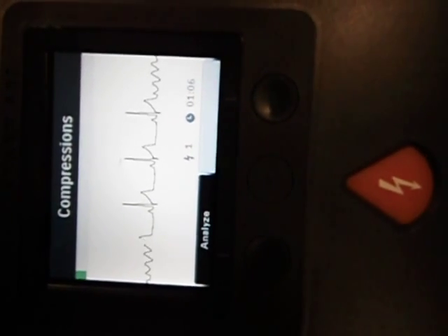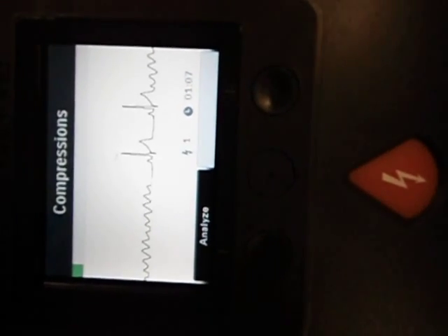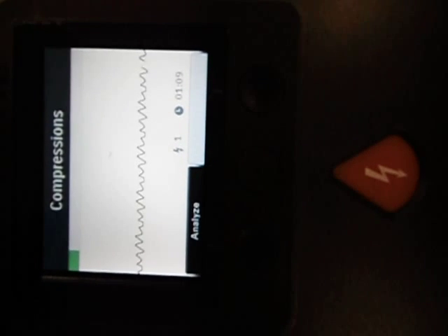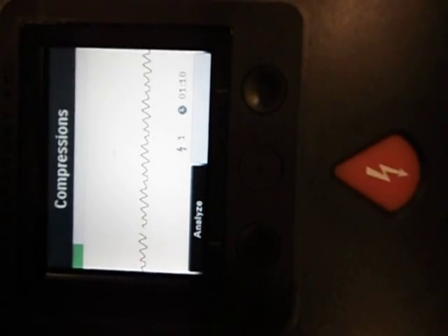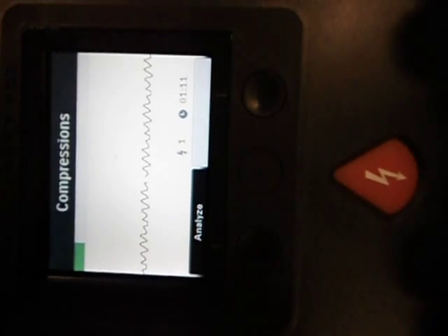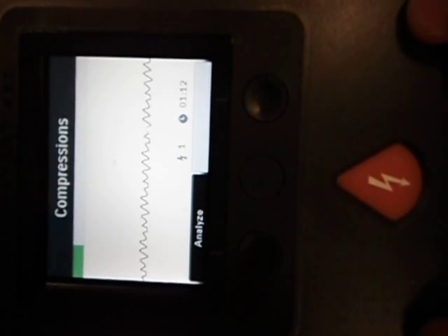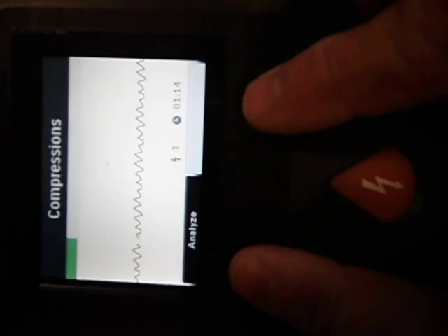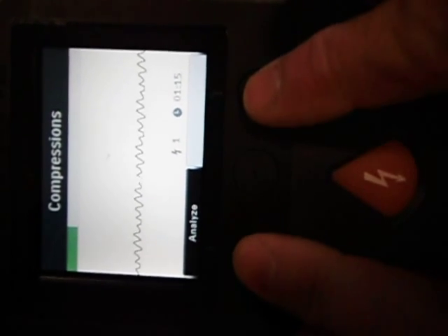All right, so we delivered a shock. We're in full auto mode. If we would like to go to manual mode, we would push both buttons simultaneously.